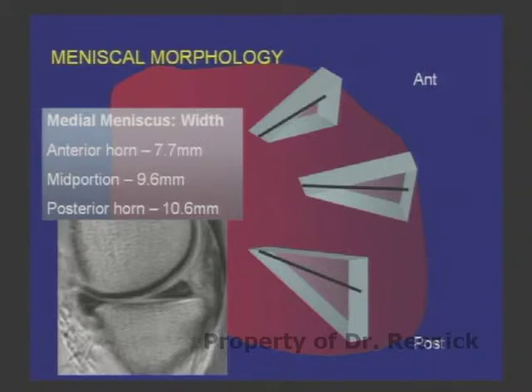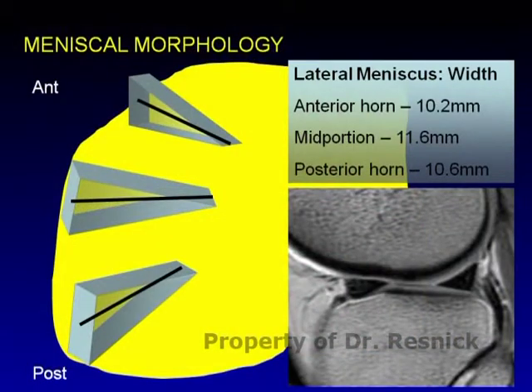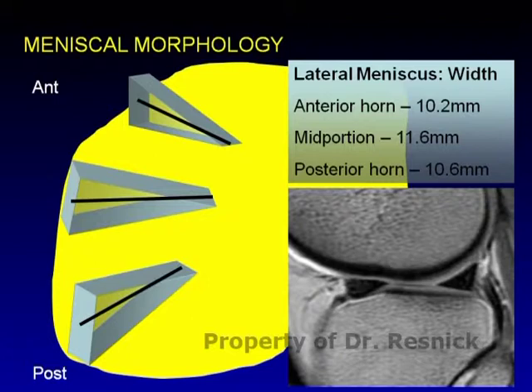If there has been no prior surgery, this is what I expect to see scanning the medial meniscus. On the lateral side, the three portions are approximately the same width — statistically, the body of the lateral meniscus is the widest. Always be concerned if the body is truncated on the lateral side. On sagittal images, the widths of the anterior and posterior horns of the lateral meniscus should be approximately equal — that's a quick check.